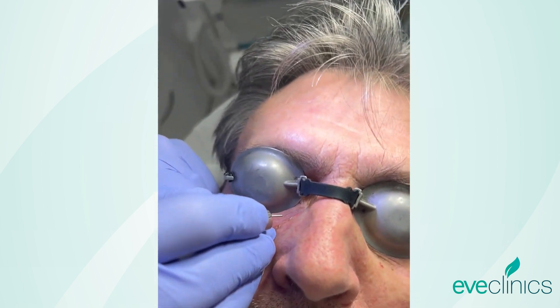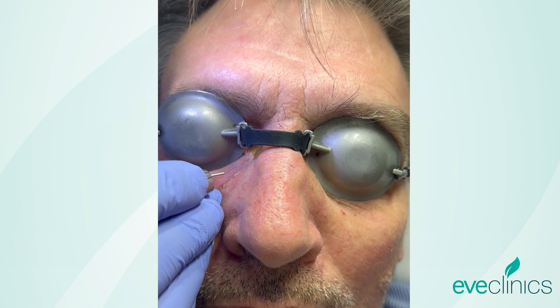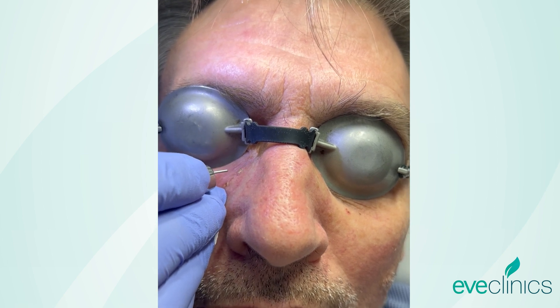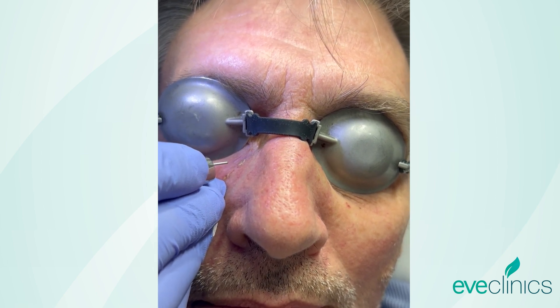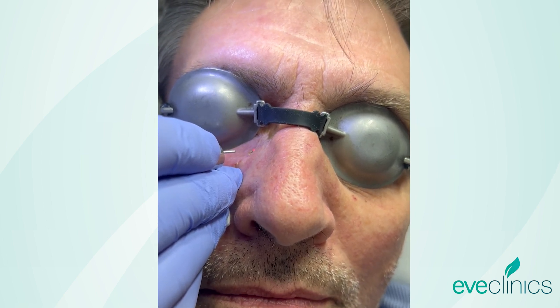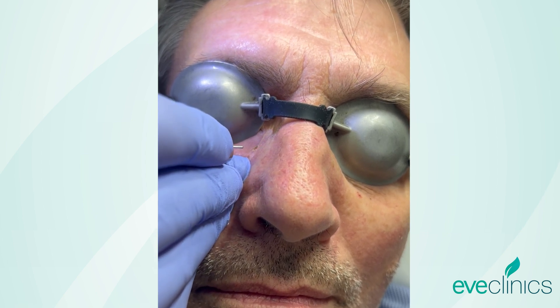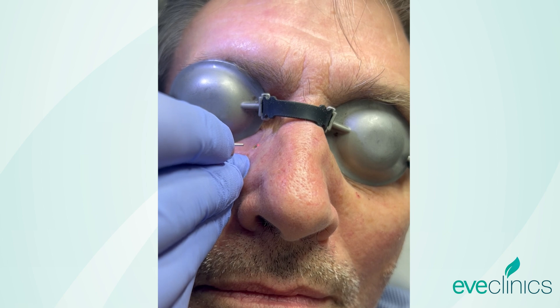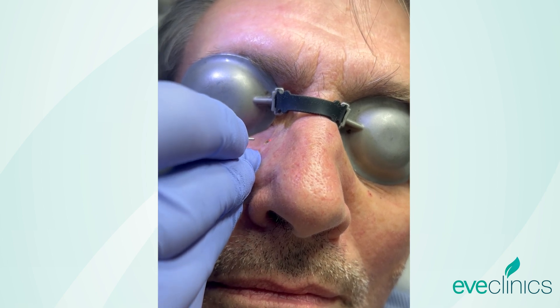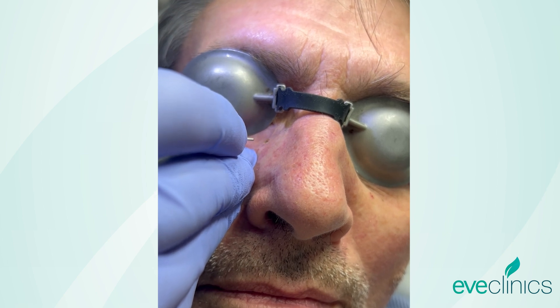Do you feel anything at all, sir? Not really. There we go — that's the beauty of the local anaesthetic. How long will that take to wear off? A couple of hours, you'll start to get some sensation back. All you'll get is a sort of gentle, warm, throbbing sensation — really nothing more than that.